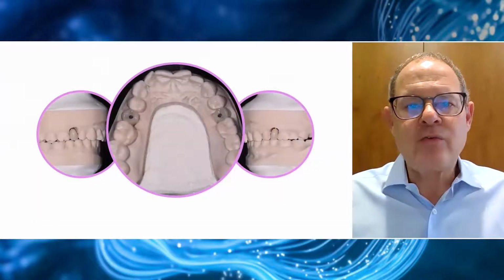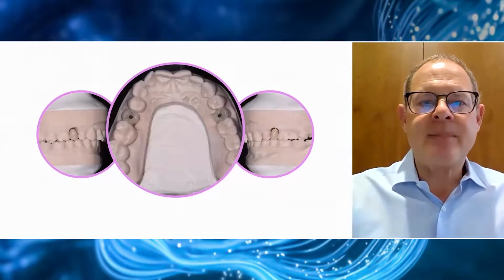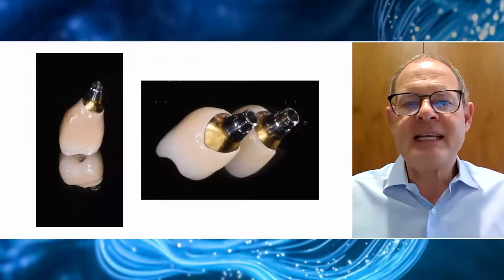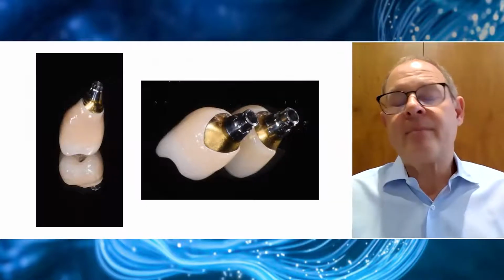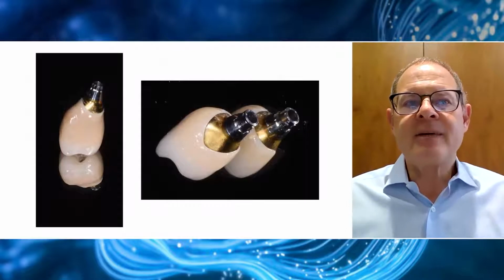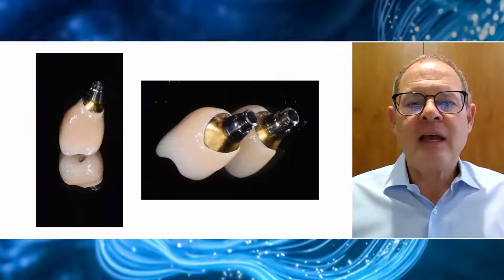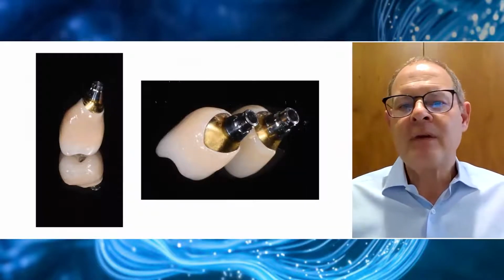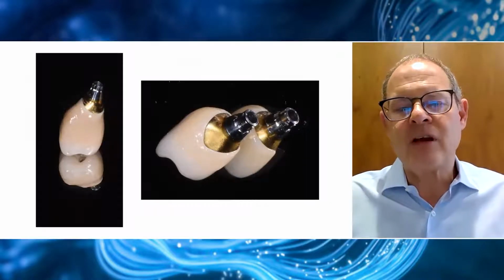And here we see the two crowns on their Atlantis custom base abutments. And in this case, we've got this gold hue, which is the titanium nitride color, the gold color, which gives a better shine through the soft tissues. And once again, we can establish these really superb emergence profiles. And there's virtually no ledge between where the crown meets the abutment margin. It's a perfect transition zone.